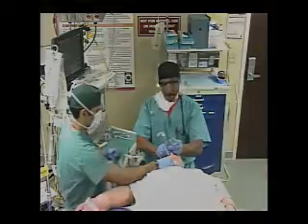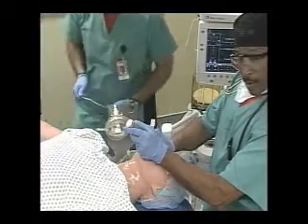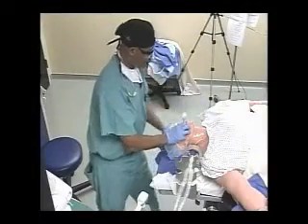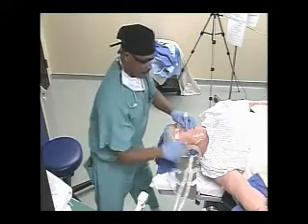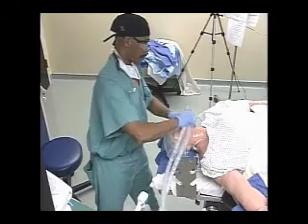Once your ET tube is in and it goes through the cords, you stop and have someone pull your stylet. And then continue to insert your ET tube until your balloon passes the cords. Take your laryngoscope out, close it up. Inflate your balloon with 10 cc's of air.